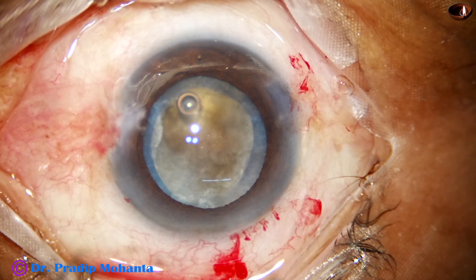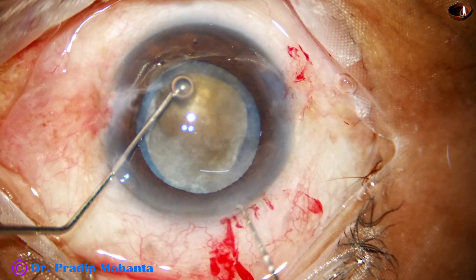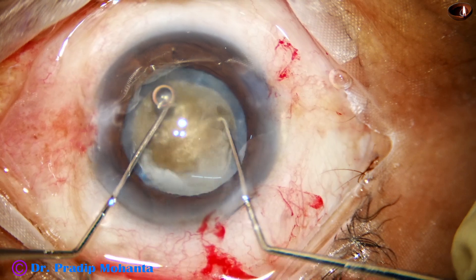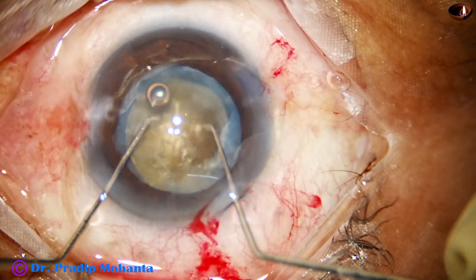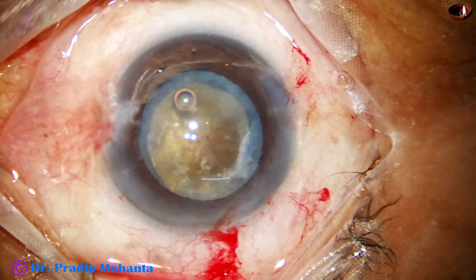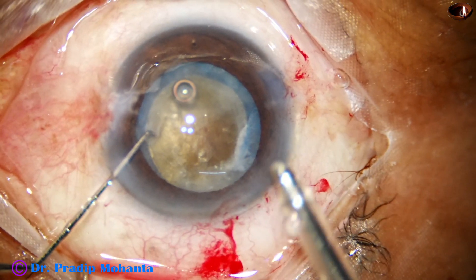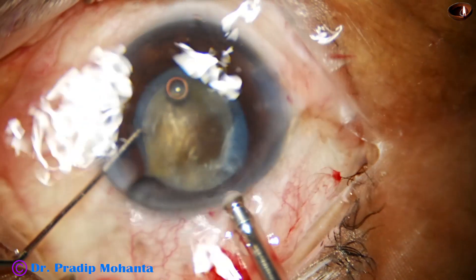I am using the Oertli CataRhex 3 phaco machine. Before introducing the phaco needle, I rotate the nucleus with two hooks. This is bimanual rotation of the nucleus and it is a lens-friendly maneuver.